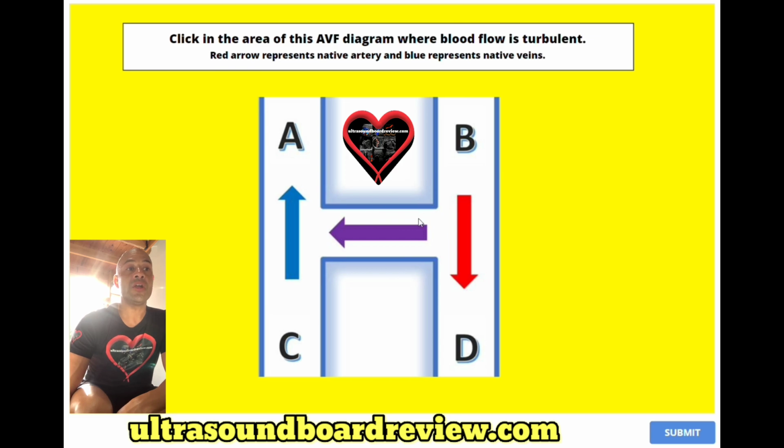The answer is right here. You'll find turbulent flow right in between the artery and the vein.